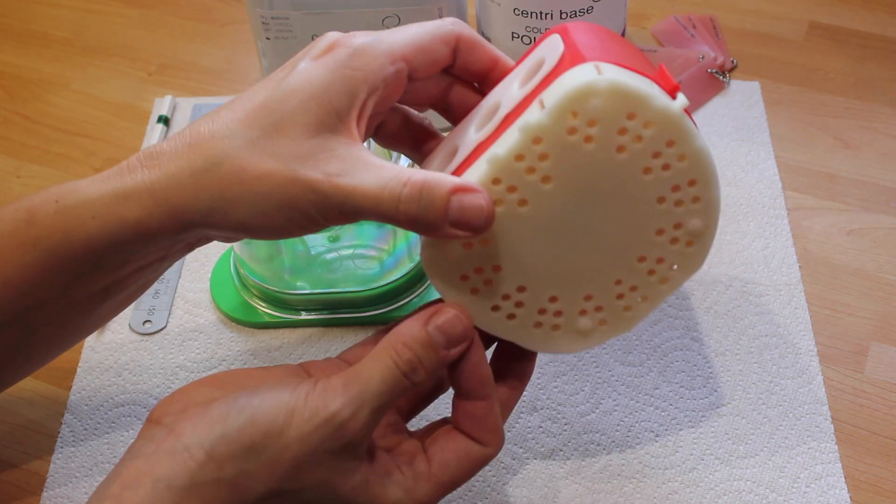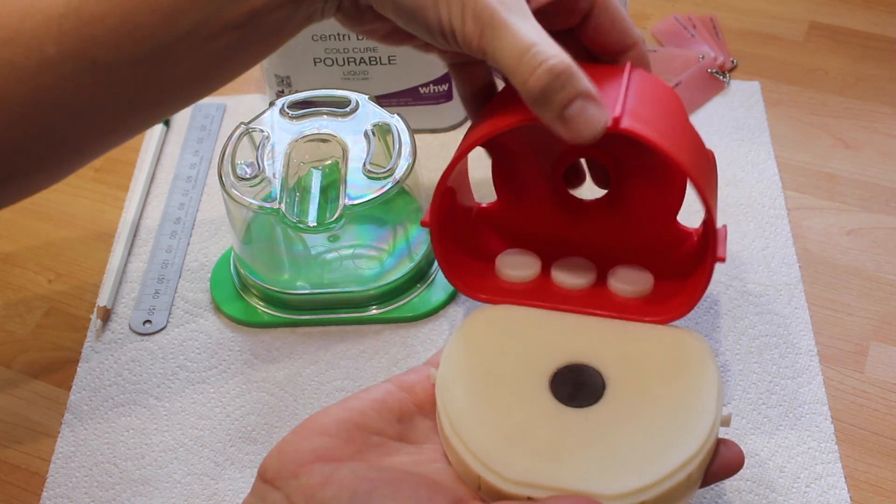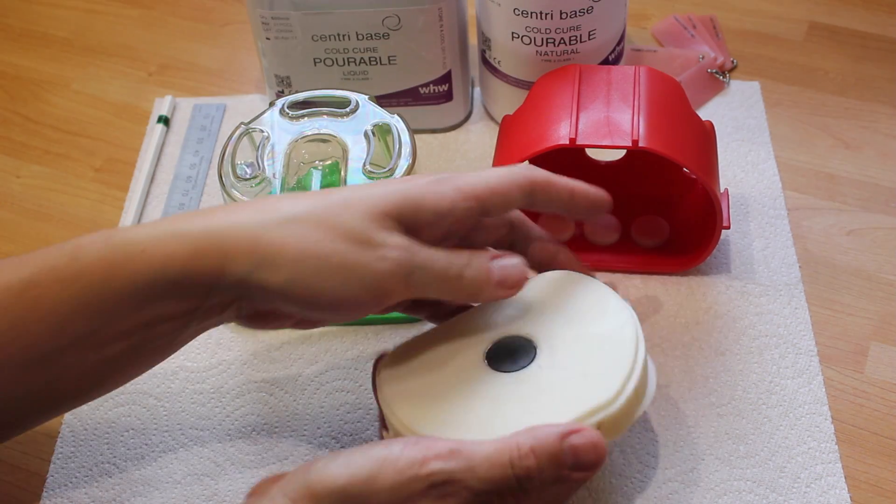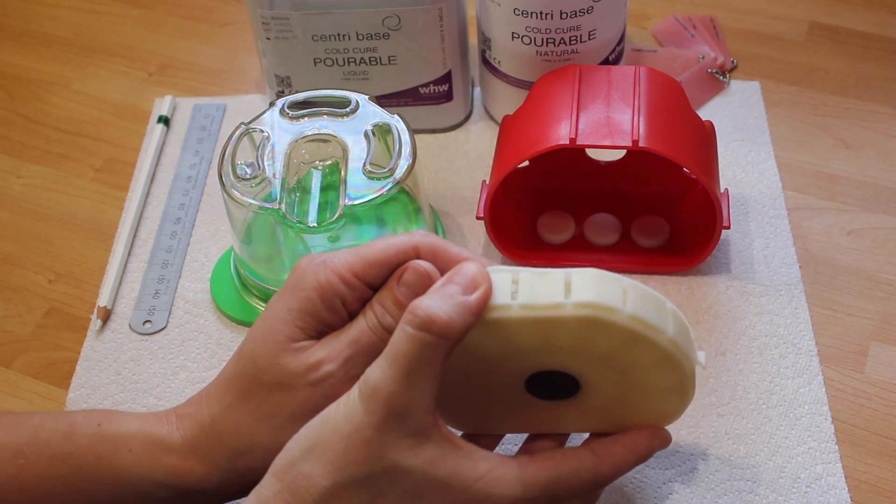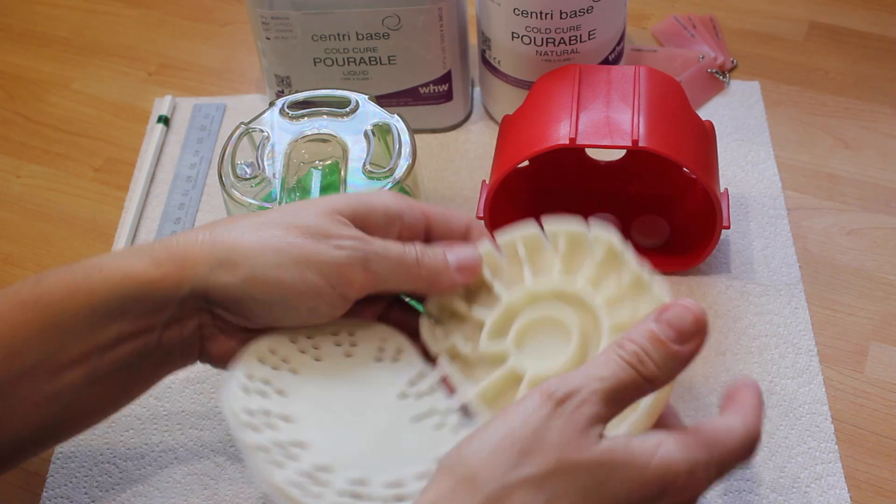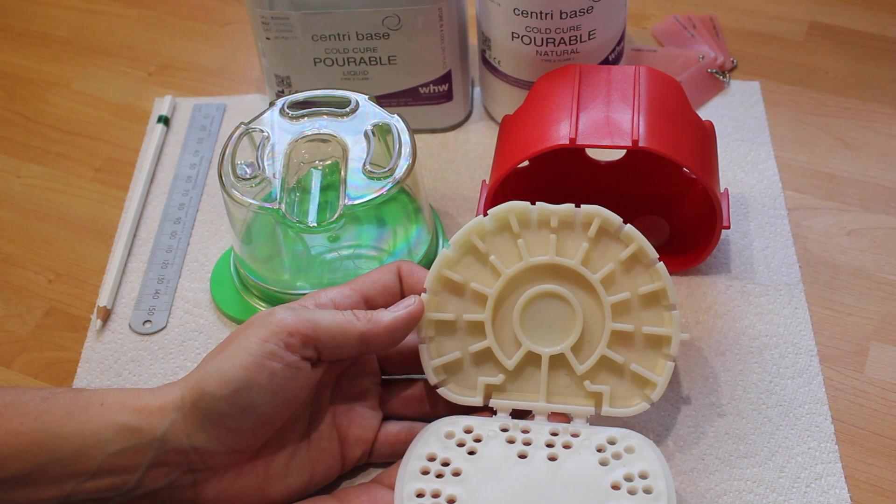Some have lugs on them where you can attach an elastic band for security. Some like this one have a magnet in the base compatible with articulator systems and some have channels for boiling out your teeth to prevent you mixing them up.